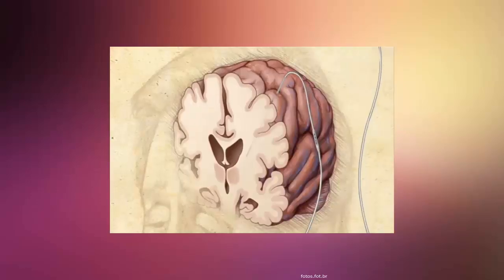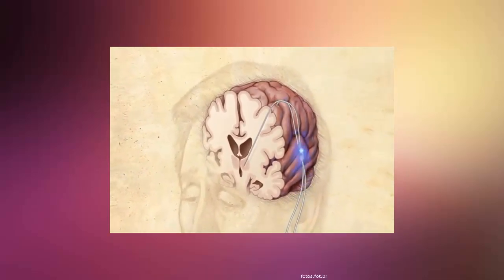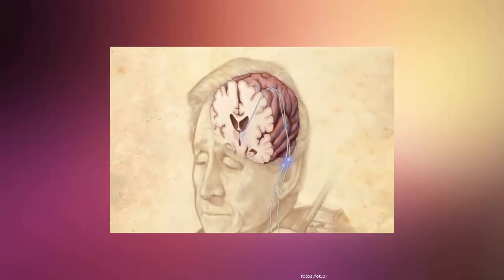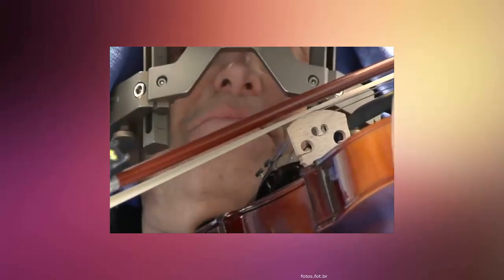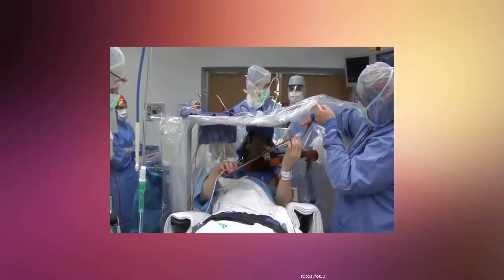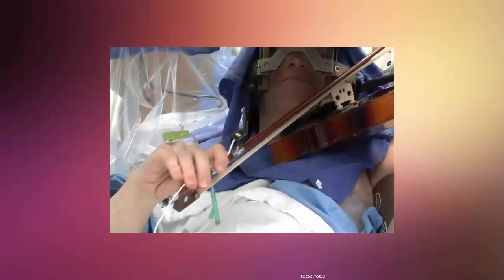"We built and designed a 3-axis accelerometer that we could attach to the bow so that as Mr. Frisch was playing, we could actually see a plot on a computer screen of the movement that really shouldn't be there." During the procedure, Dr. Lee inserted electrodes into Roger's brain and moved them to the site where the tremor originated. Once there, electrodes fire electrical signals to hopefully stop the tremor. By measuring Roger's movements, the accelerometer told Dr. Lee if the electrodes were in the right spot. There was no guarantee it would work.